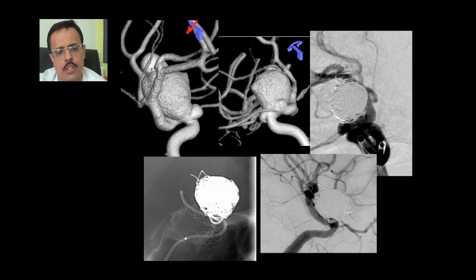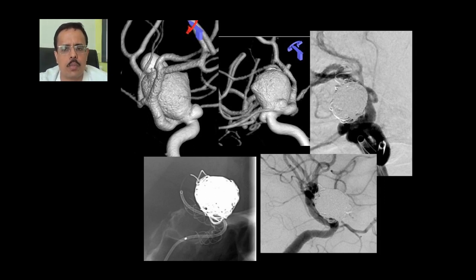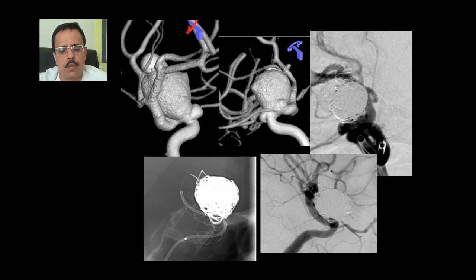Another patient with a giant, complicated, multi-lobulated aneurysm presented with bleeding. In the acute stage, we coiled the aneurysm, and at a later stage we placed a flow diverter stent. The follow-up showed complete reconstruction of the residual aneurysm — it looks like a normal artery now.